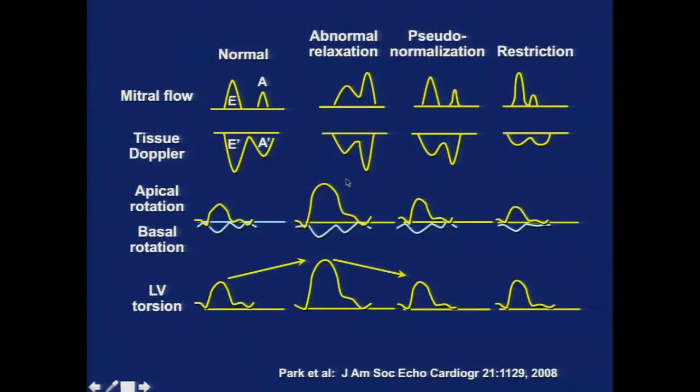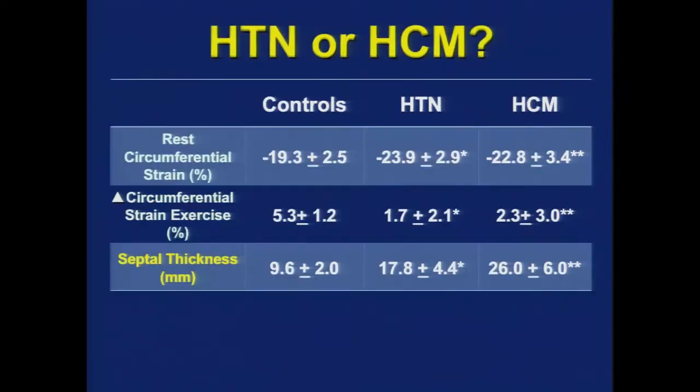Remember we said that when longitudinal strain is depressed, that rotational or circumferential strain may be augmented in order to maintain systolic performance? And this is exactly what you found. That compared to controls, remember their longitudinal strain was depressed, but circumferential is augmented. And so they have that sort of parameter of function that we were talking about earlier.